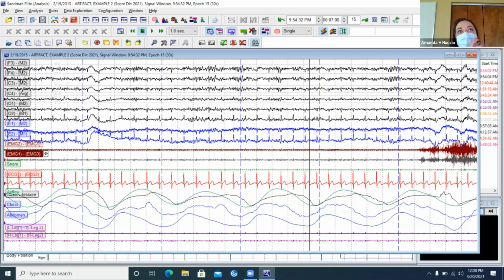On the chin, though, it's so important to get that kind of change. The muscle tone changes are related to the patient's wake, sleep, whatever. So it's easy to miss if there's 60 hertz coming through on it, which is one of the reasons why biocals are so important to check, like when you tell the patient to crunch, are you seeing that?